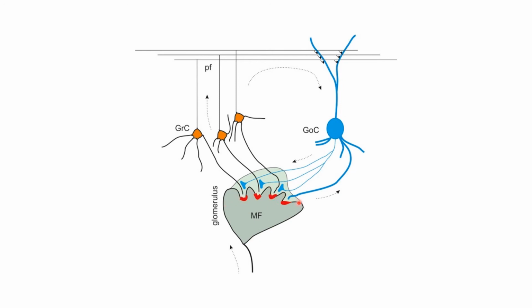These are called rosettes. And this whole thing, with the dendritic processes of granule cells, mossy fibers, and axons of the Golgi cells, together forms an encapsulated area called the glomerulus, and the capsule is formed by the astrocytes around them. These are islands present in between the neurons.